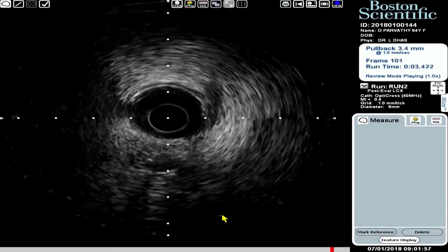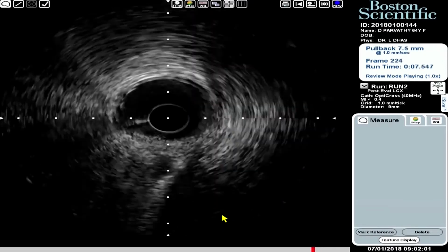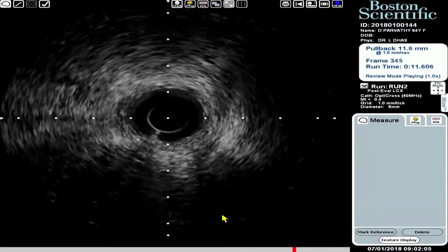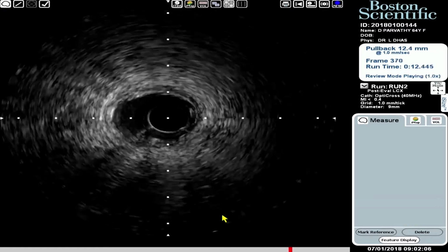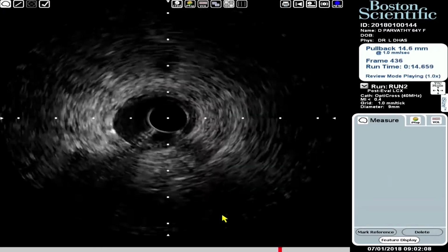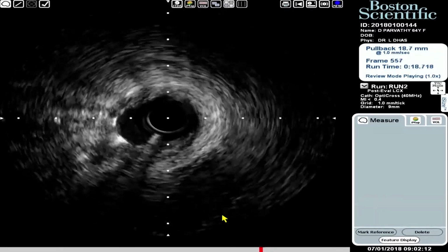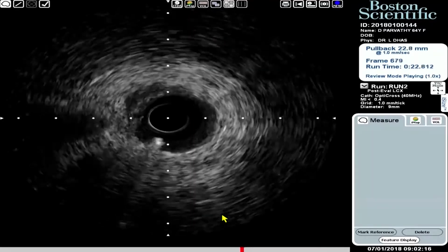We have sized the stent up to the vessel size, so it should be okay. Can you see the distal vessel? Distal vessel looks very small. It's around 2 millimeter. So here the stent starts. There is no dissection, and the stent is close to the vessel wall. So it is well expanded and we are coming back and you can just see still it is close to the vessel wall. So I don't think we can expand anything more. If you expand more, it will rupture.